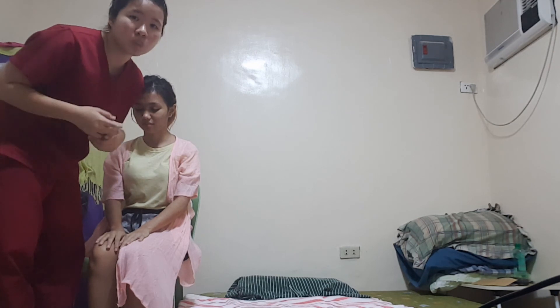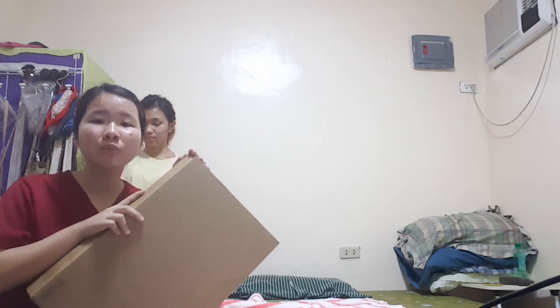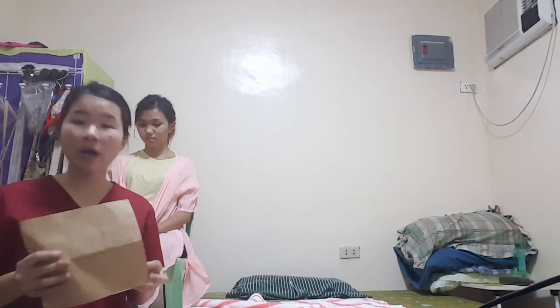Now the next variation: using a slide board. This is for clients who cannot stand but are able to cooperate and possess sufficient upper body strength. Use a slide board to help them move without nursing assistance. You place the slide board between the bed and the wheelchair and slide the patient so that the client can cooperate with the nurse during the course of the procedure. After completing the procedure, you need to document all relevant information gathered while performing the procedure.